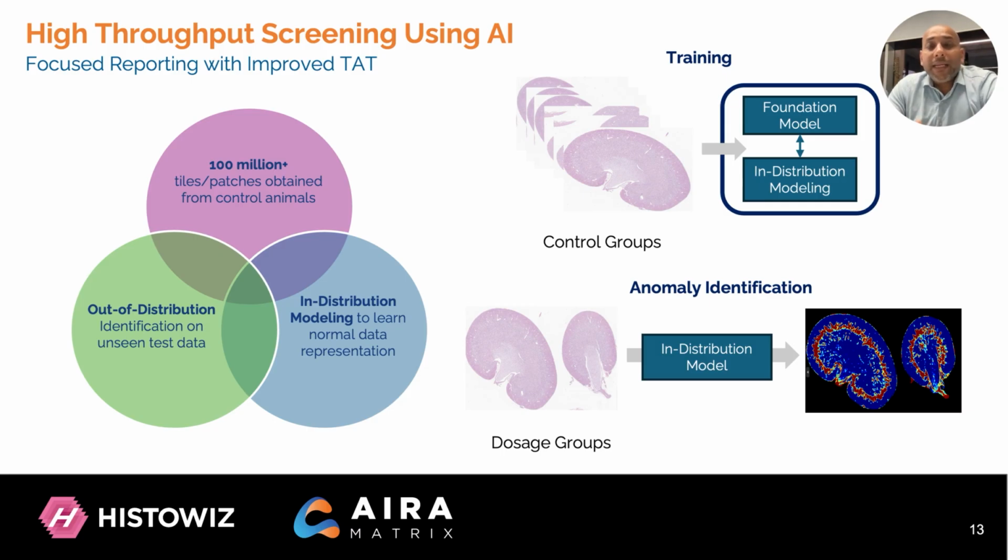Furthermore, by integrating these unsupervised anomaly detection models into preclinical workflow, we can detect novel toxicological patterns that might have otherwise gone unnoticed, offering early warnings on compound toxicity before clinical trials, ultimately leading to safer drug development.